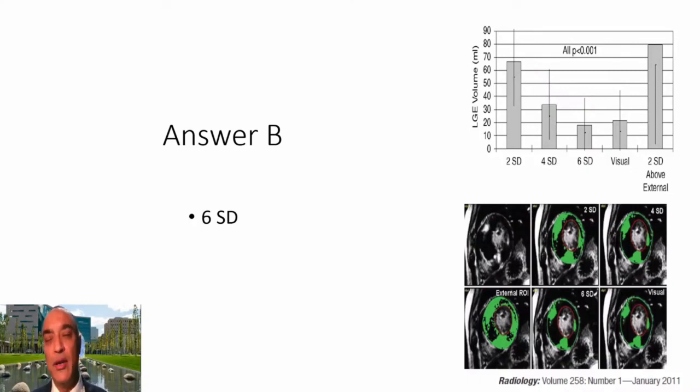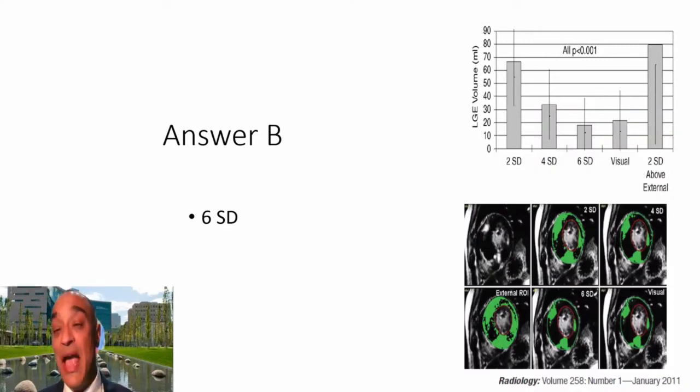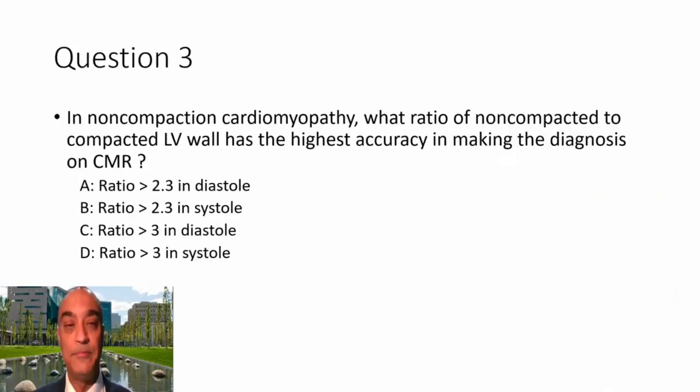So it is important when you get the report of how much scar there is, how much fibrosis there is, you ask your referring radiologist or cardiologist how they are measured, because the values can vastly differ based on what thresholding you use. And you don't want to be putting in a defibrillator wrongly in somebody who does not really need it. So this is important to remember.